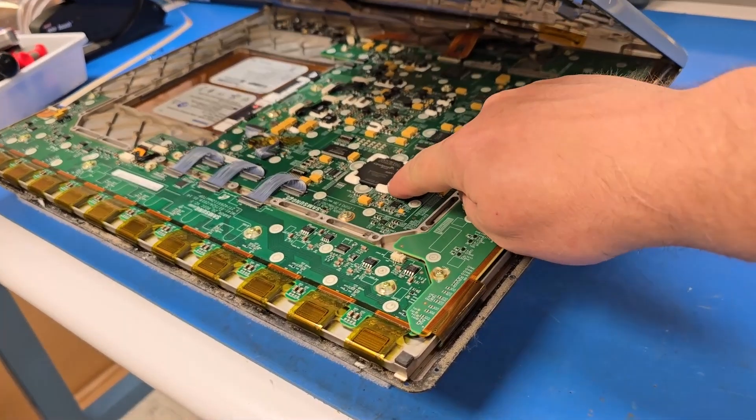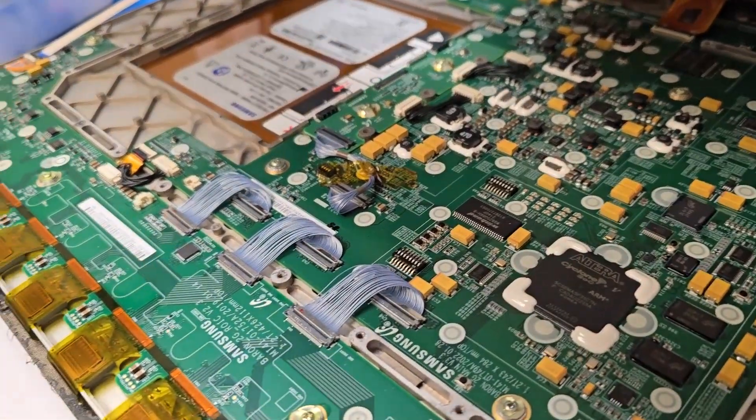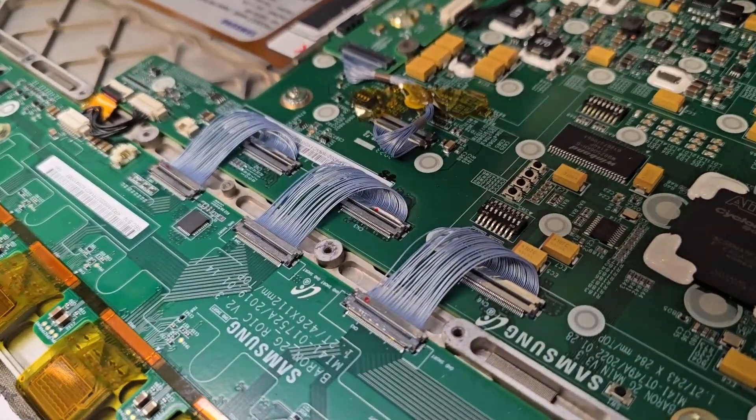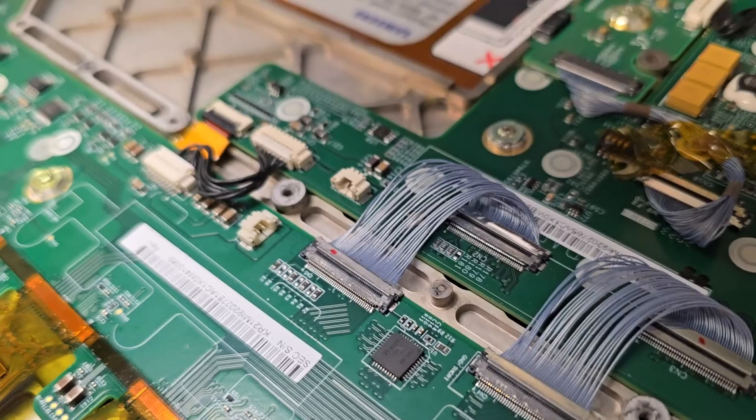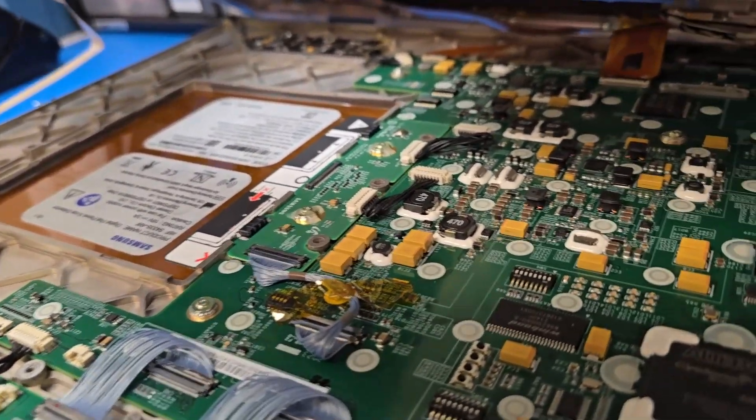I see that they put a lot of silastic around a lot of components, and they do that for durability reasons. The interconnects are beautiful. Something I would honestly expect from Samsung is a lot of microelectronics. Right here you can see this is a composite material — it's all machined. Take a look at all those machining marks.